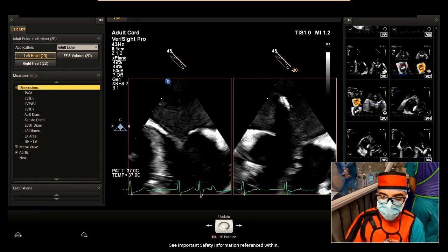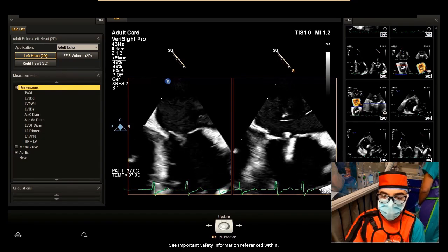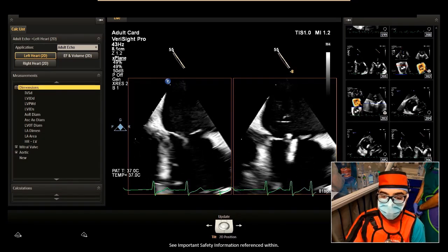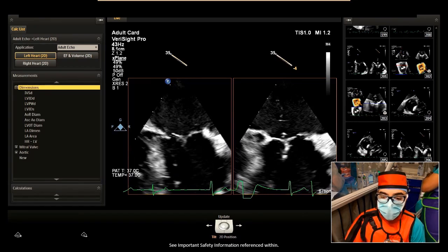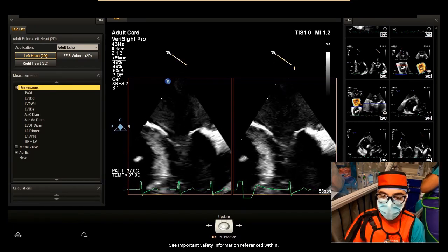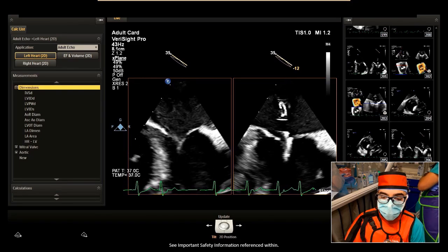If you felt like this angle wasn't the right angle, and you're the imager in control of the machine, you can actually just change the angle you want. You can see right now it's at 55. You can change the angle to what you feel would be right. But since we're using 3D navigation, things are quite precise, so we really just stick with the 45.